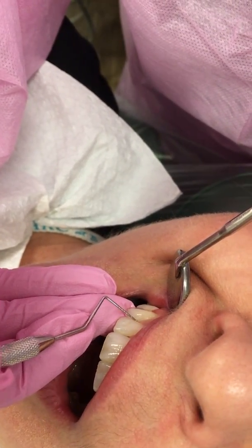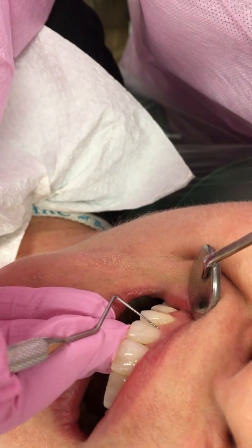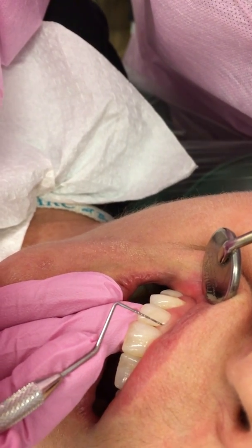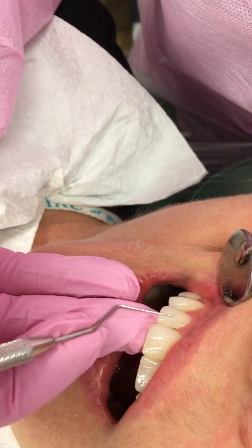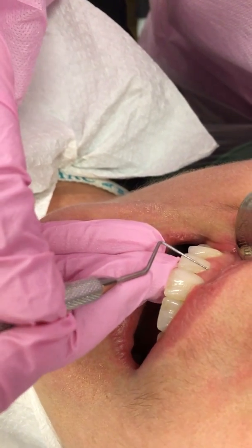You're not. I've got a modified pen grasp and a fulcrum, and I'm as parallel to the long axis of the tooth as I can be. And I am allowing for the height of contour at the cervical third. So you notice I'm not coming in straight like this because then I miss the gingiva. I have to allow for that height of contour.